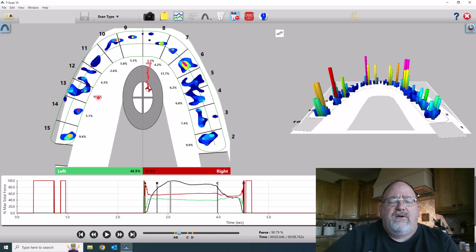Here is a little more of a bread and butter type case where a patient had 6 crowns across the front for cosmetic reasons, done by a prosthodontist in her area, and she was having problems with her bite. They were getting ready to do a neurologic consult and refer her out to one of the university clinics because she was having some pain issues.